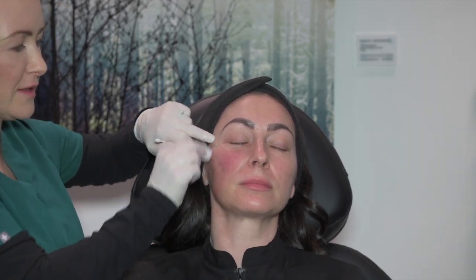And finally on this side, we'll proceed to inject the nasolabial fold. This patient does not have a deep nasolabial fold, so I assess that she will only need 0.5 mils, and for that we're going to use Volift.